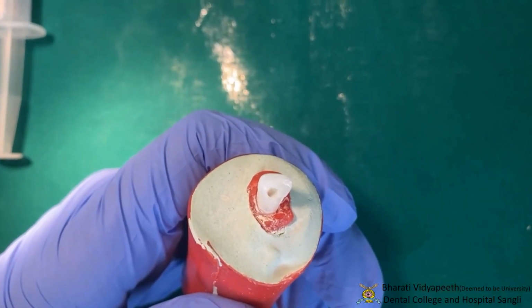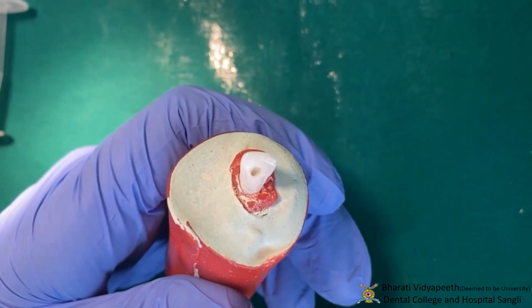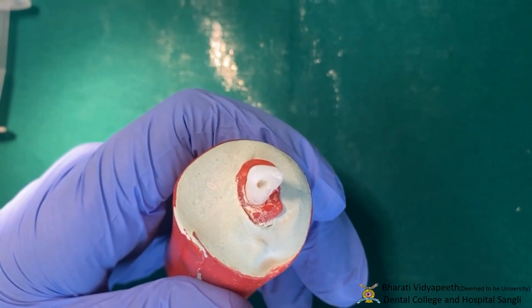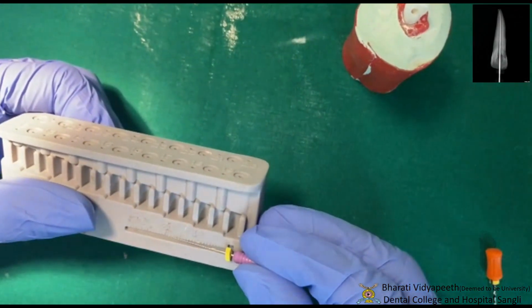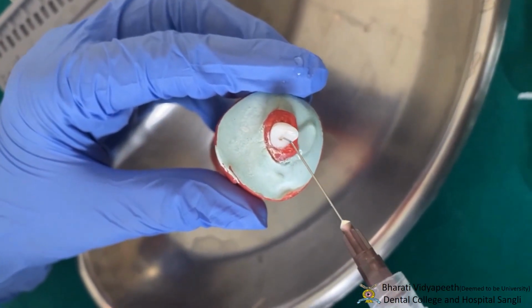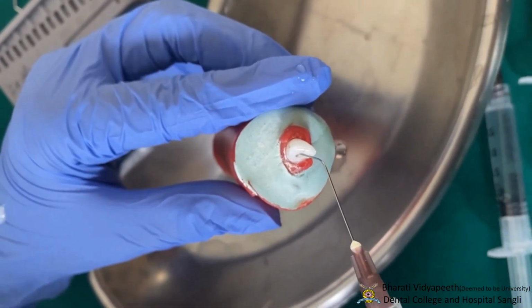Phase 3 involves determining the working length. Working length is defined as the distance from the coronal reference point to the point where the canal preparation and obturation should end. Working length was confirmed radiologically. The working length determined here is 22 mm. Irrigation is done with the help of sodium hypochlorite. Following irrigation with sodium hypochlorite, the canal is flushed with normal saline.